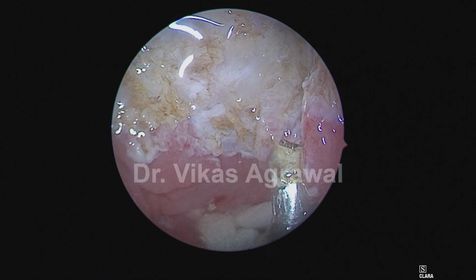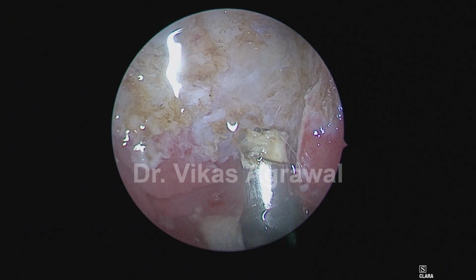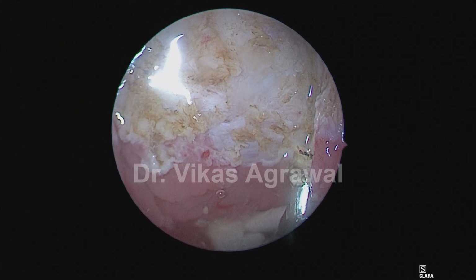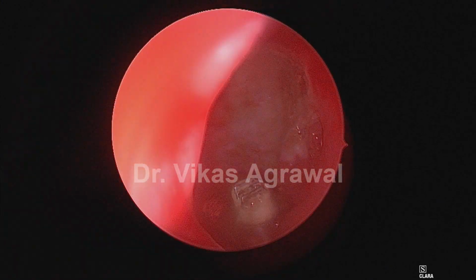So, near complete removal of all the lymphoid tissues on the left hand side. Fine. So now I'll come to the right side. Thank you.